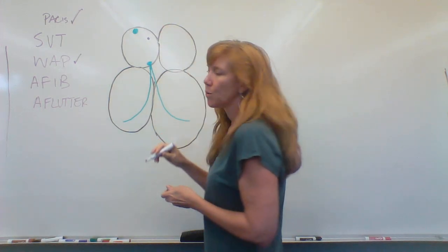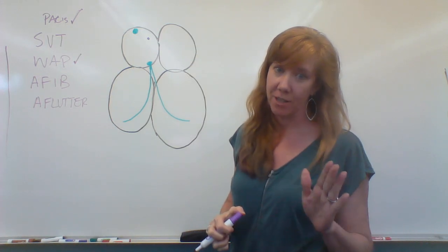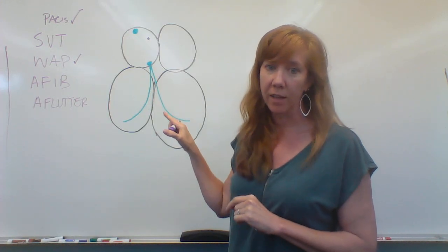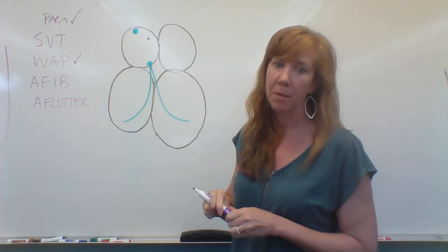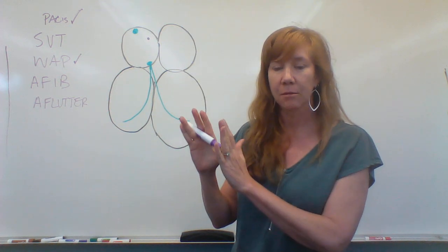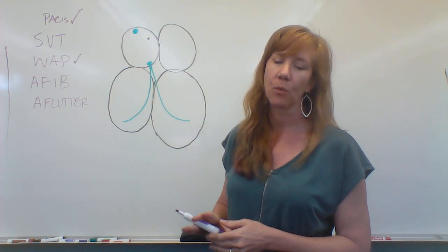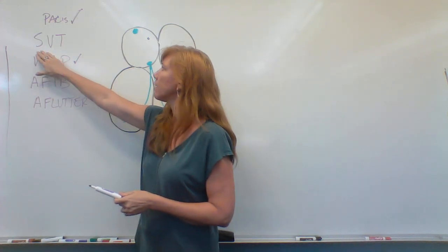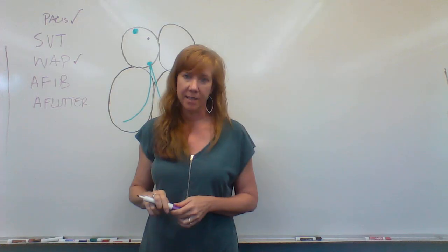So let's say this one cell is seriously agitated and he is getting very fast, definitely over 150 for sure, maybe over 160, maybe even getting up over 180 beats per minute, so way over what sinus tach would normally be, and that's one way we're going to differentiate supraventricular tachycardia from regular old sinus tachycardia.